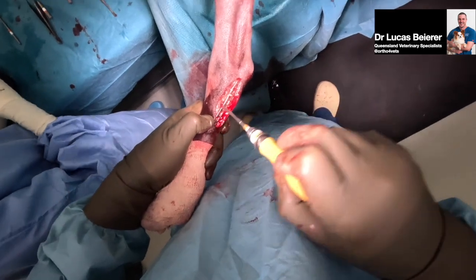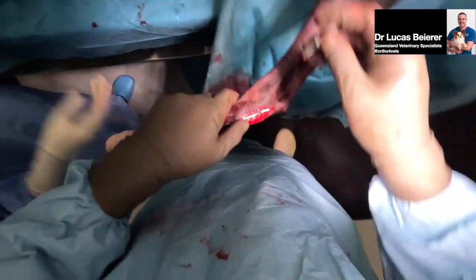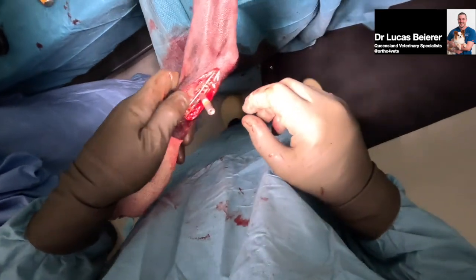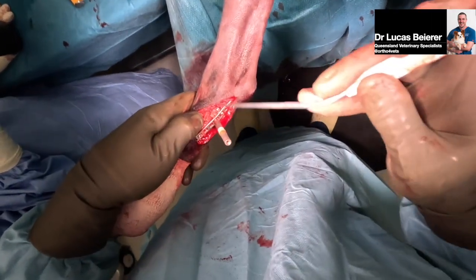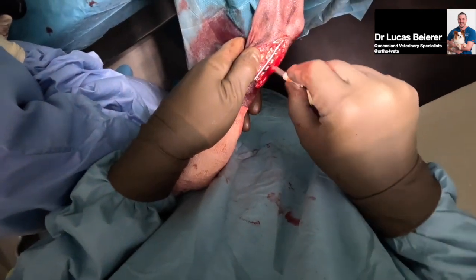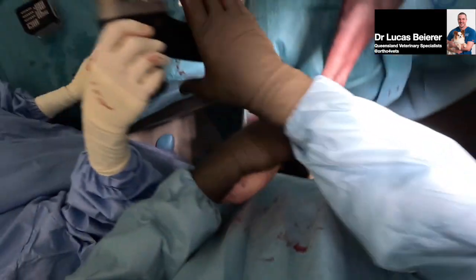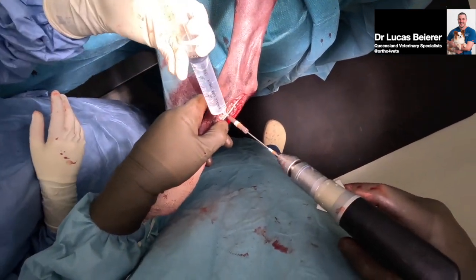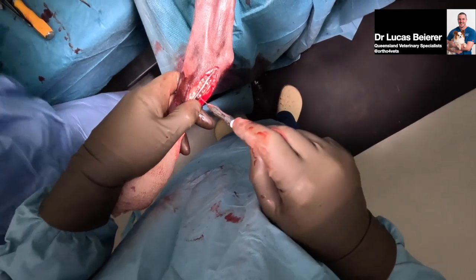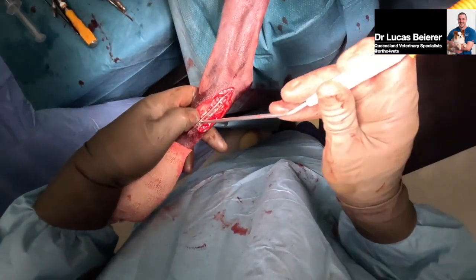So if we put a locking screw in there, that's below the calcaneus, which will be in the 4th, so that's probably a useful bit of anchorage to have. That looks like a good idea. I think that's where it is. Maybe not, maybe one more space below is the way to go. Then just see our joint there, which is around that hole, so we'll go above that. This will be in our 4th. I think that's getting very close to the central tarsal bone implant, so we'll just put a little monocortical in. We just put a 12 in, the advantage of locking screws in this location.